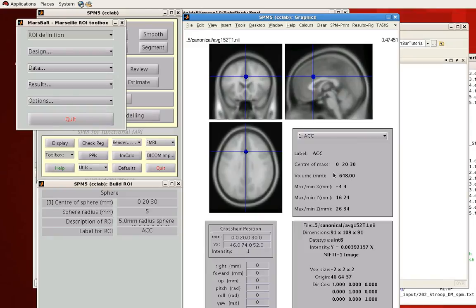So you can see the center is located at 0, 20, and 30 in MNI coordinates. And it's roughly located where I wanted it to be located.